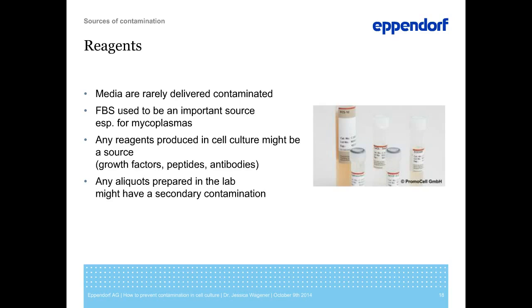And then, any aliquot prepared in the lab carries a potential risk of contamination. The person preparing the aliquots might have made a mistake in aseptic handling, and your stock might carry a contamination.